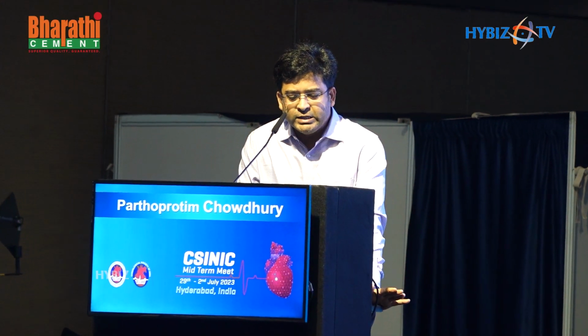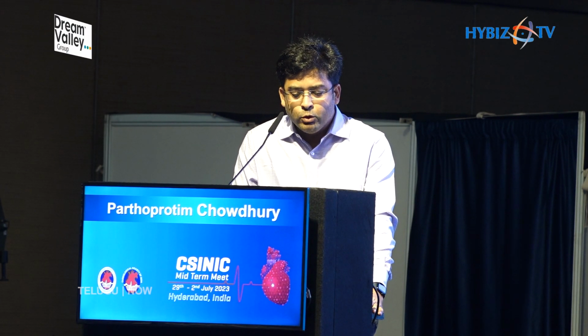Anomalous left coronary artery that arises from the RCA with an intramural segment and interarterial course has the highest chances of sudden cardiac death. Basically, it's challenging, time-consuming, with good radiation exposure and contrast exposure, and it requires a lot of equipment too. Even more challenging is the setting of primary PCI.